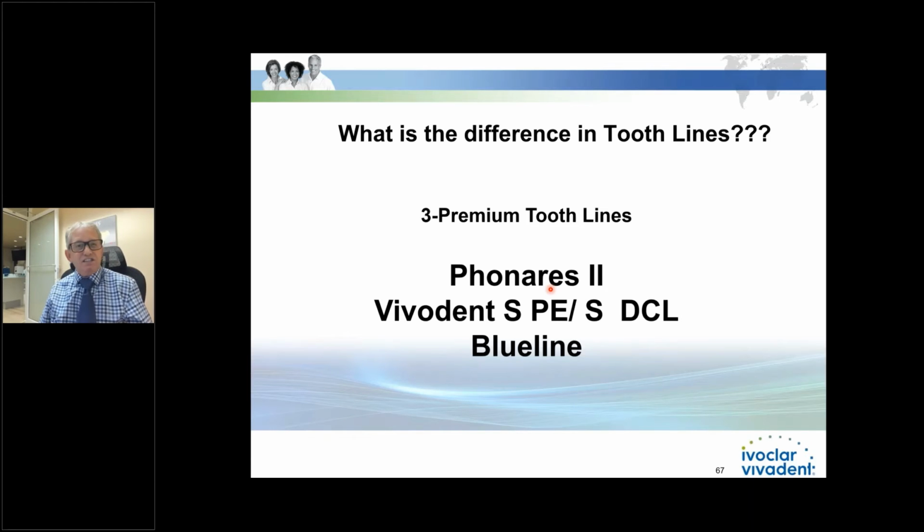But it's kind of tough to make a preliminary denture for someone, and then you're going to change, because you can't always get the same mold, can't always get the same color, and then you're going to make a definitive denture later. Patients don't like that because people see them, they get used to them, and now all of a sudden you're changing them again.